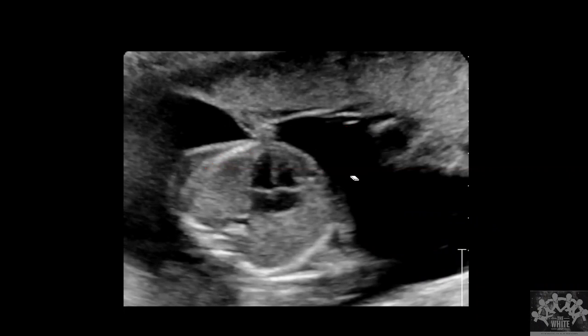If I'm seeing a heart and surrounding the heart there is fluid, this is nothing but amniotic fluid. It's a fetal antenatal ultrasound. There is a chest in which we can see the lung, a collapsed lung. There is no air there. And there is a heart, appearing as a four chamber view. We can see the water is appearing blacker. I told you water will allow all the sound to pass through, so it will appear blacker. The lung will appear slightly grayish, and the bone is appearing whitish.